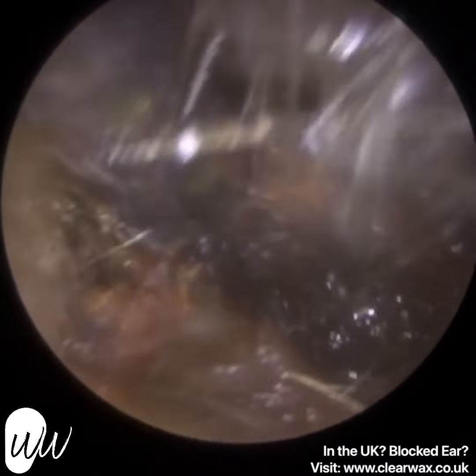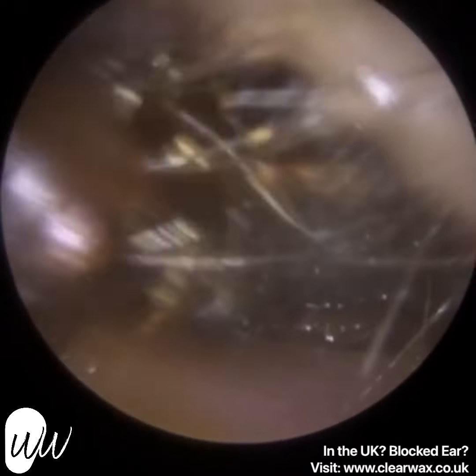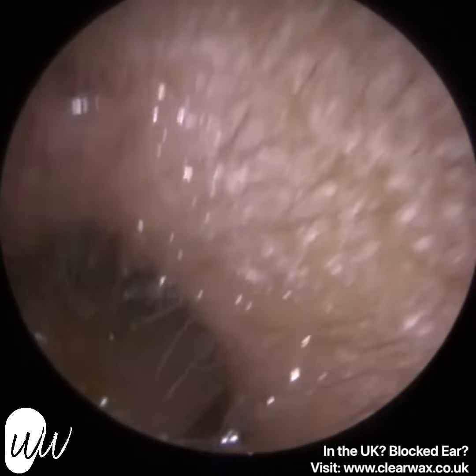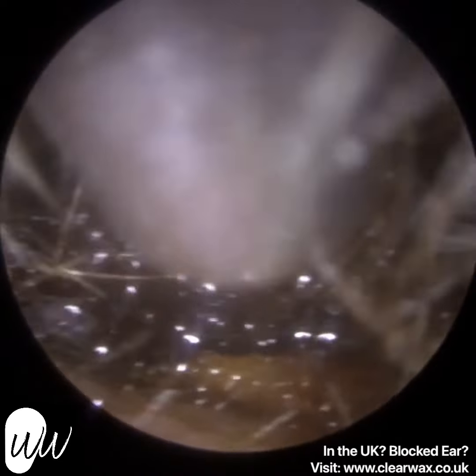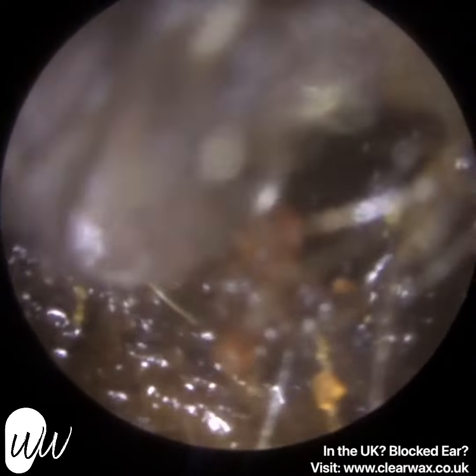But they weren't able to hear it, and it was a bit of a shock to them once I removed the wax plug. They immediately said, "What's that noise?" And I had to explain it was the suction machine. They were quite shocked once they realised how noisy it was.